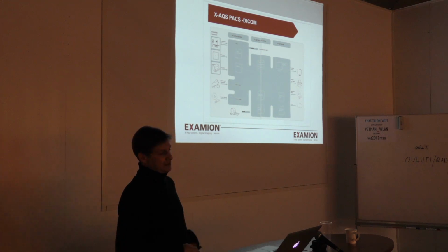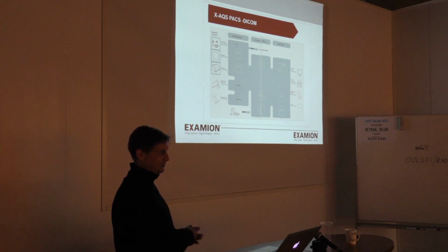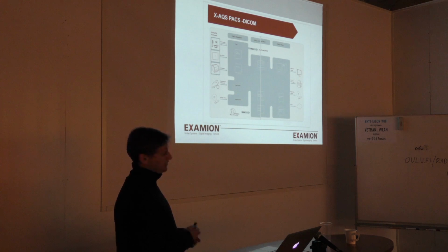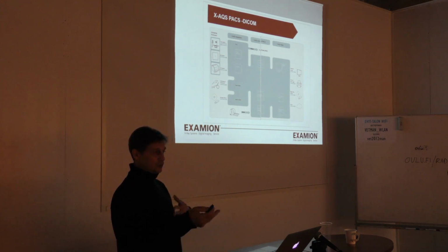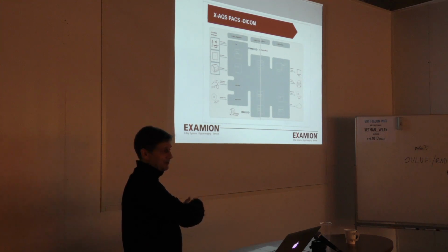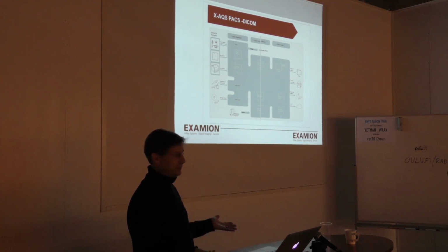More and more in veterinary, in the past it used to be viewing stations within the clinic. Then it went to mobile viewing stations within the clinic, so that people wanted to see the pictures on their iPads, their iPhones, or any other multimedia devices. Then it also went outside the clinics, whether you work together with other clinics or you are in a veterinary group. They also want to centralize their DICOM data. This means the data need to be sent automatically to a central device, a server somewhere within the group, where everybody that needs access has it ready for them.